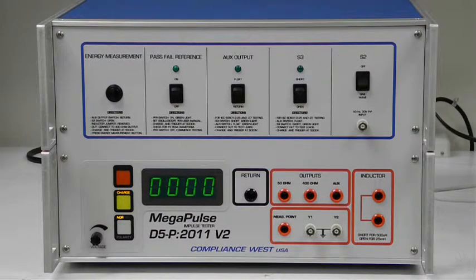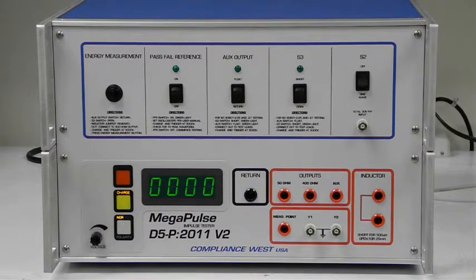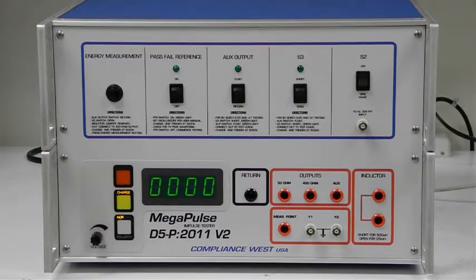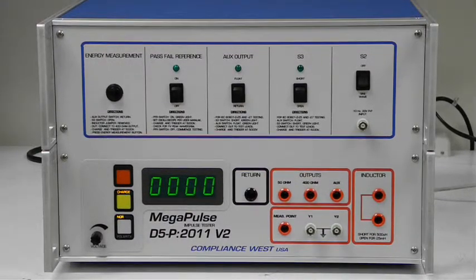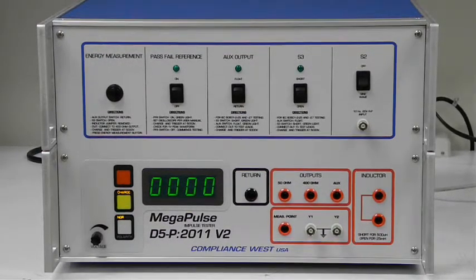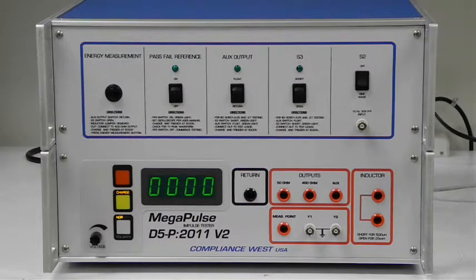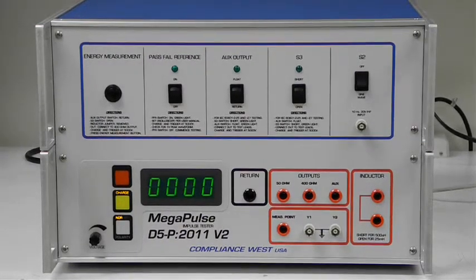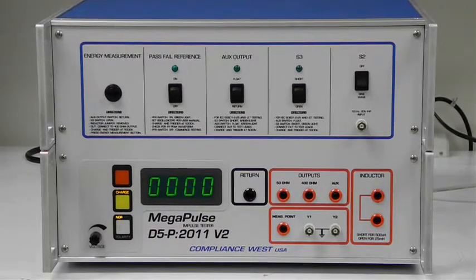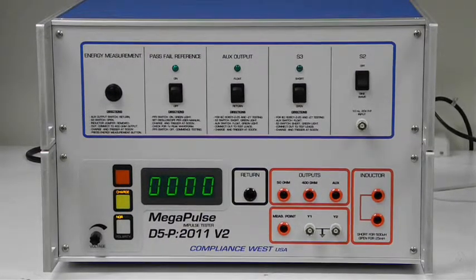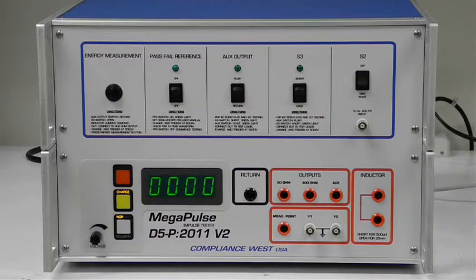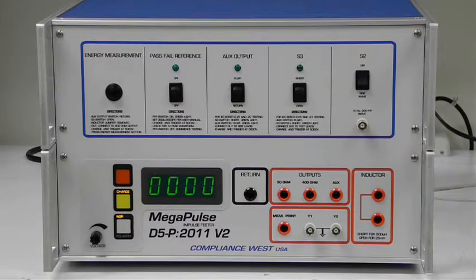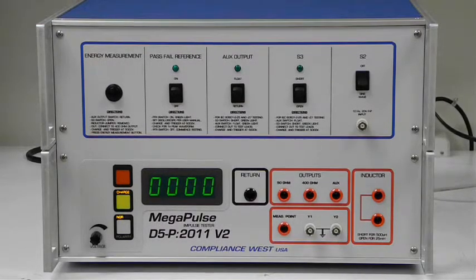The patient connection or applied part is connected to the 400 ohm receptacle on the front panel of the D5P 2011 V2. Remember to ground all the other patient connections and or applied parts.